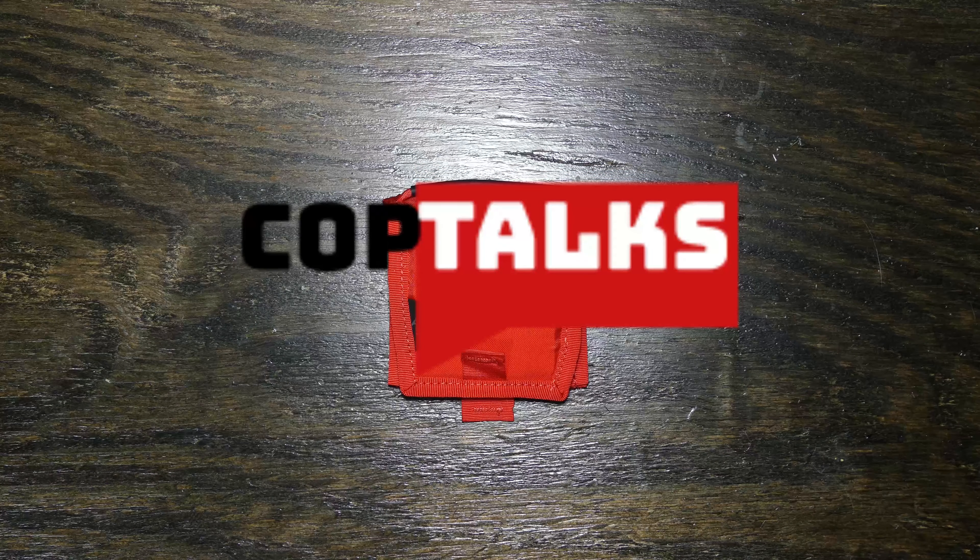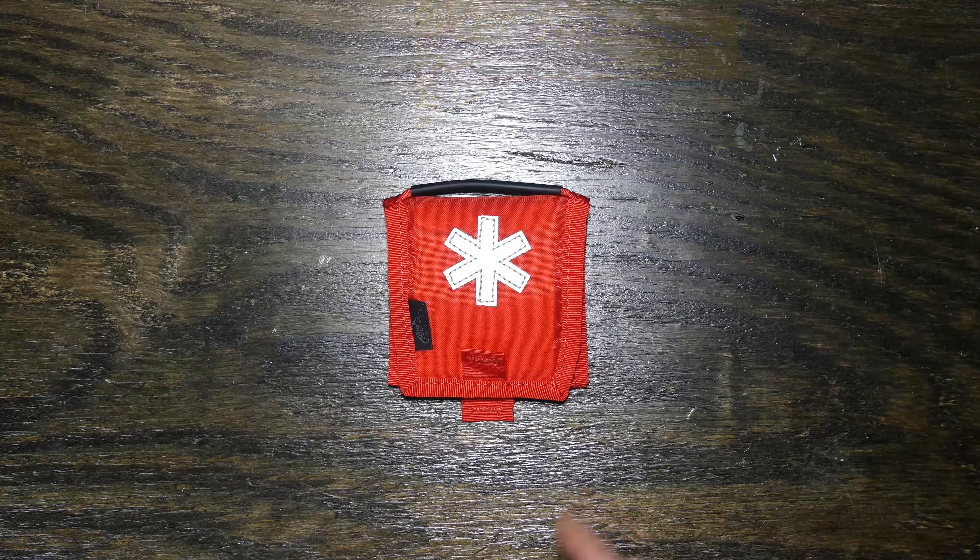Hey there guys, welcome back to the channel in another video. So today I wanted to talk about the Helicon Tex Micro Med Kit.